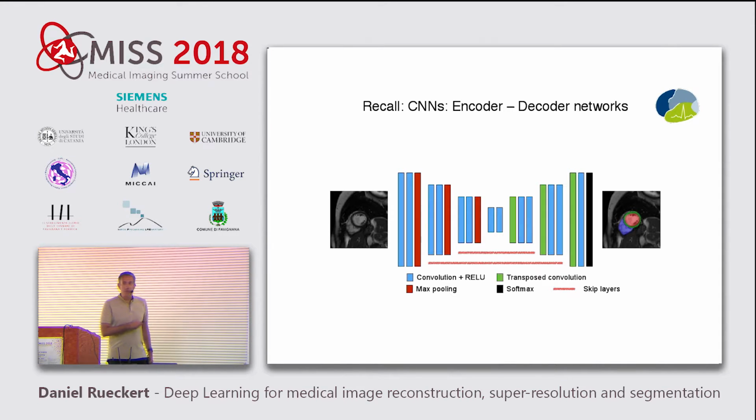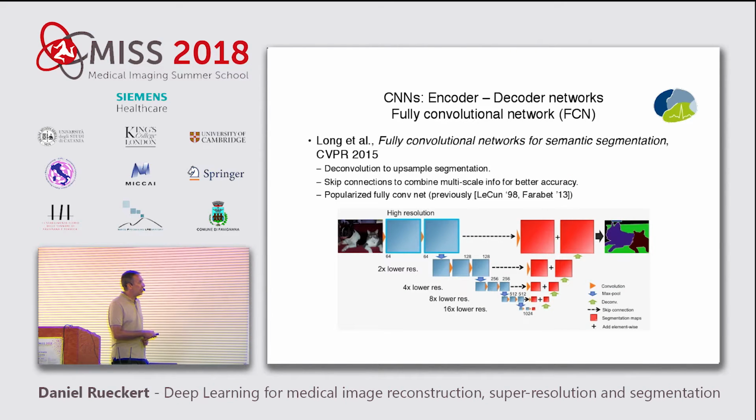It's also worthwhile to remember that there are two very frequently used architectures here, and we'll swap a bit between them. The first one is probably more familiar, what people in the computer vision community know well: the fully convolutional neural network from Long, which takes your image, analyzes the information and reduces it before upsampling, for example for semantic segmentation.